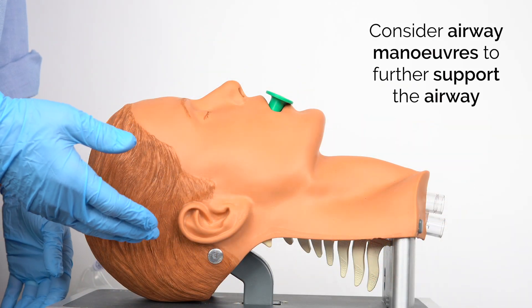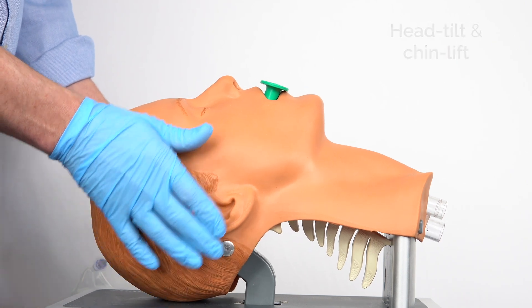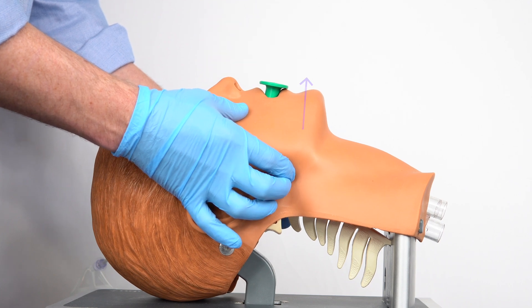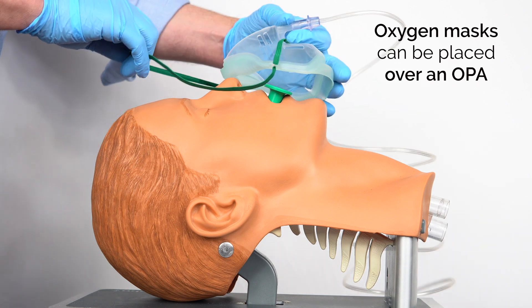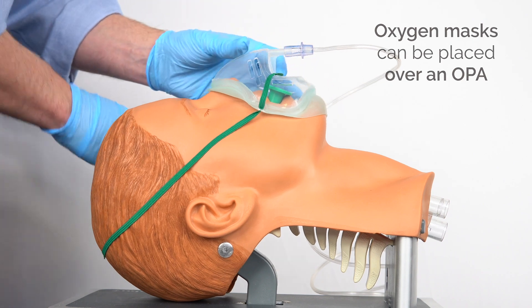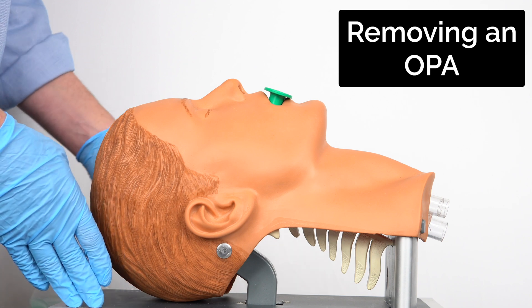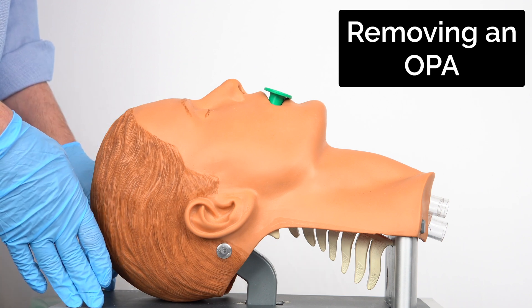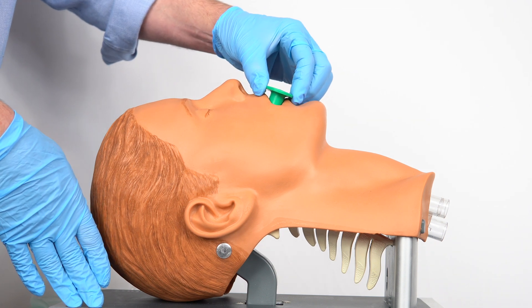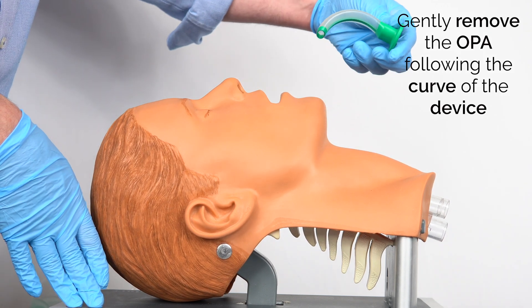Once the Guedel is in place we may still need to do simple airway opening maneuvers to make sure the airway is patent. This could be a head tilt, or more likely a little jaw thrust, just to make sure the Guedel is sitting neatly in place. Once the airway is secured we can add in oxygen if the patient requires it. As the patient begins to regain consciousness we may decide to remove the oropharyngeal airway — if we get the sense they can maintain their own airway, we'll just gently pull it out following the curve of the tube itself.